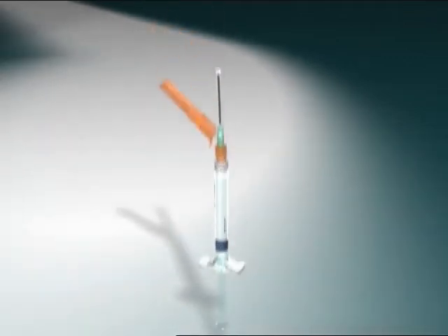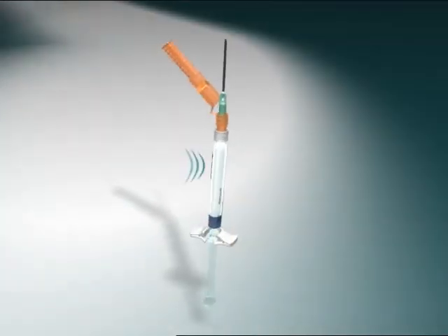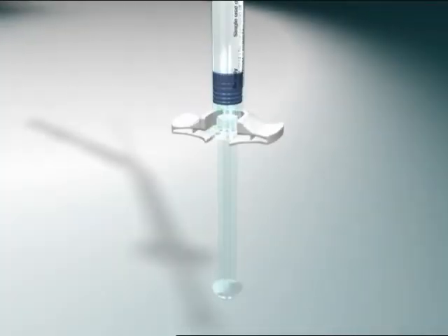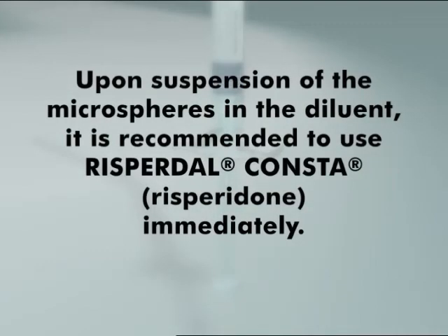If two minutes pass before injection, resuspend by shaking vigorously. While holding the white collar of the syringe, pull the transparent sheath straight away from the needle. Do not twist the sheath as the lure connections may be loosened. Tap the syringe gently to make any air bubbles rise to the top. Remove air in the syringe by depressing the plunger rod with the needle in an upright position.